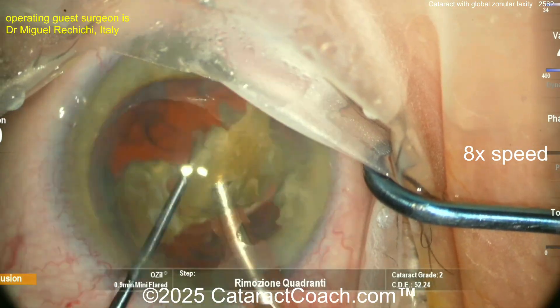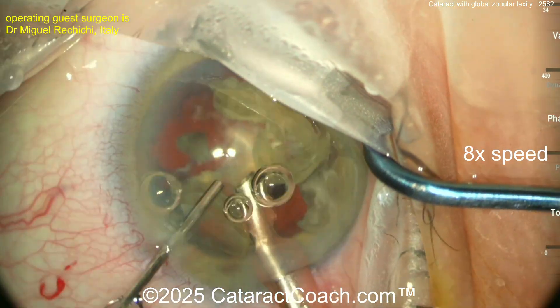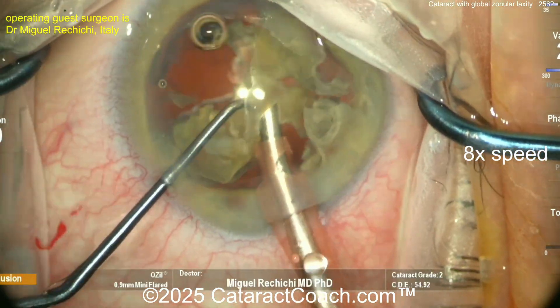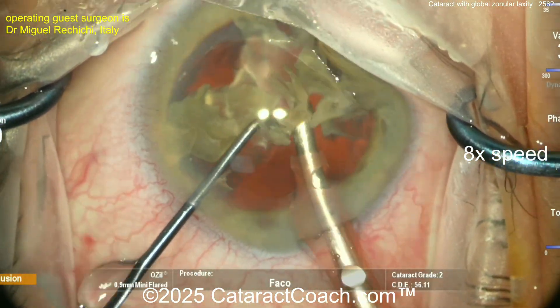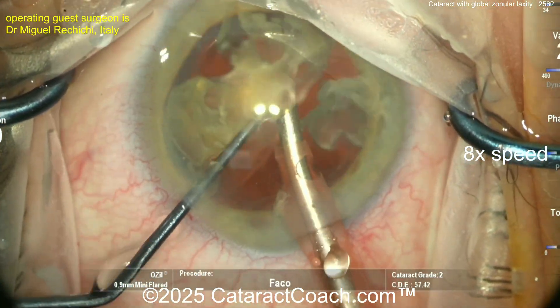It'd be nice to cut that drape so you have a full view of the cornea — the nasal drape is blocking part of the view. As a surgeon you may not realize that, but you'll suffer a little bit throughout the case. So definitely take your time to get the drapes the way you like them. Now the last bit of the cataract is coming out of the nucleus.